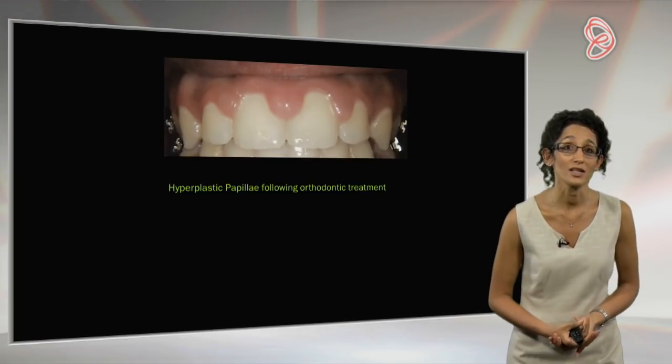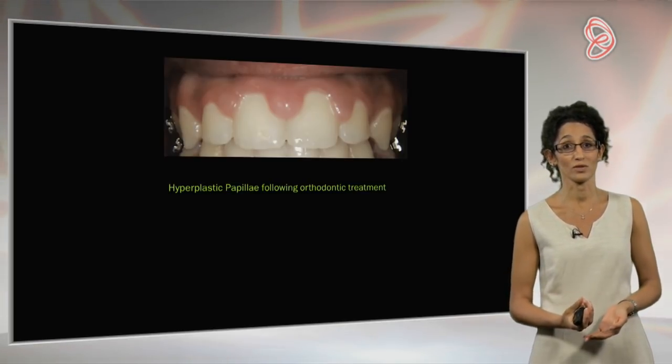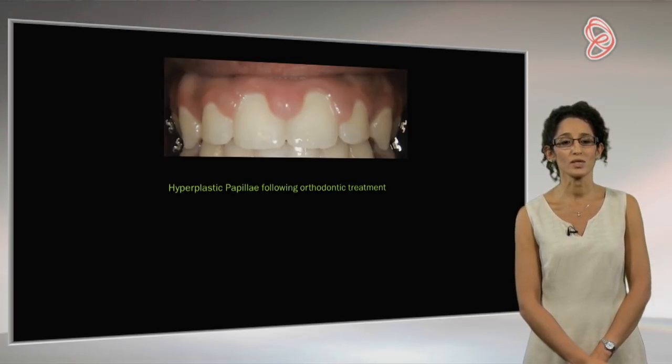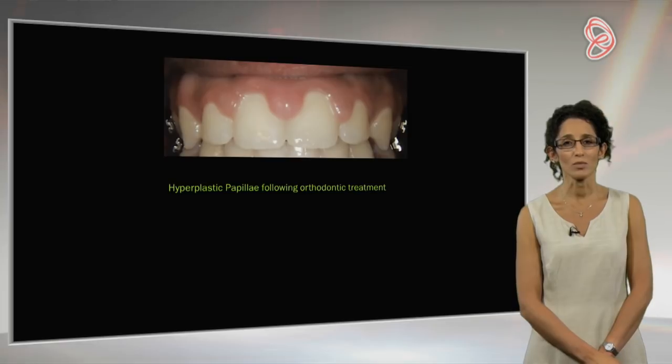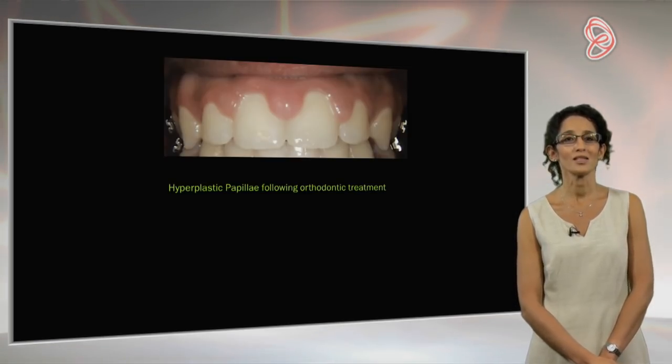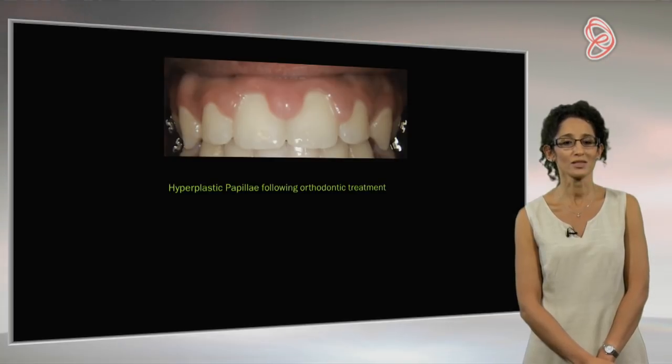Again, this is another young teenager. He just finished his orthodontics. So often the case when they have these thick tissues and they have orthodontic treatment, then what happens is their teeth get really bunched together and they end up with papillae that often look like this.